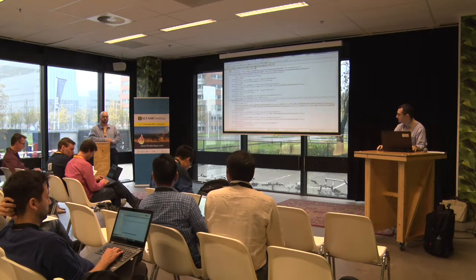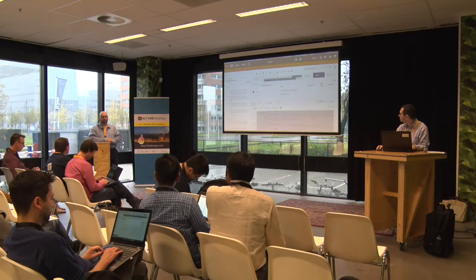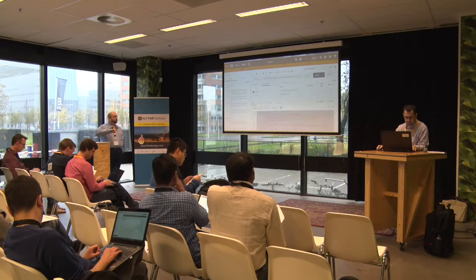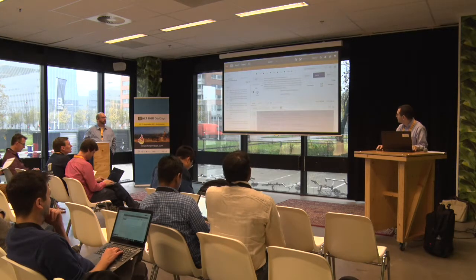And you could use QIDO not just to say, I want to see all of Mohanad's studies. I could also say, show me all the studies for the CT unit today. And I would get a work list of studies that came out today. So let's see some images just because we want to see some pixel data, right? In this case, I'm going to keep it simple and just ask for the JPEG image.